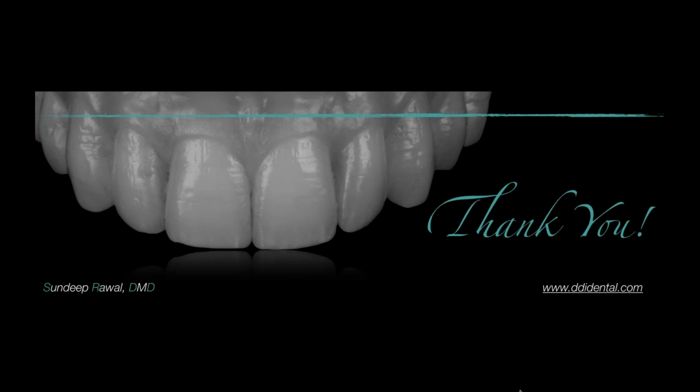All right, our next question is, how do you decide on the wax-up shapes and sizes before it's done, or are you allowing the lab to make that decision for you and the patient? So there's several different ways you can do this. If you're doing a digital smile design, you can take the time to manipulate the software, and you can create the design of the, quote unquote, let's call it digital wax-up or virtual wax-up. You can create the shape, size, everything yourself. You can rely on a dental technician to do that for you, and you can modify it.